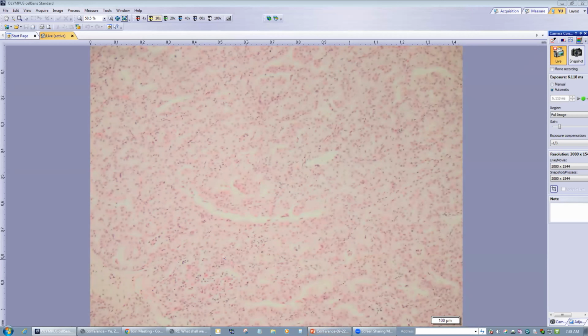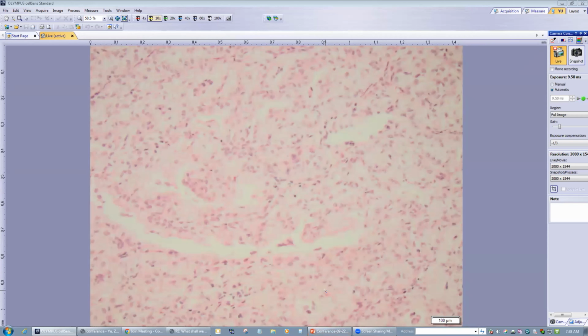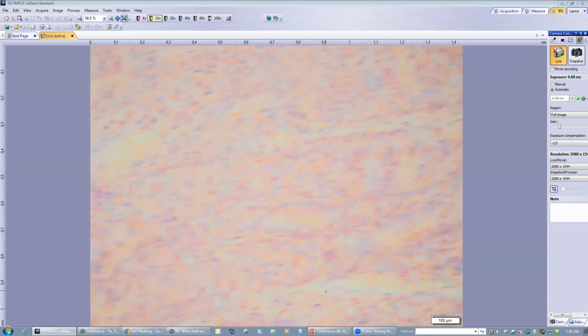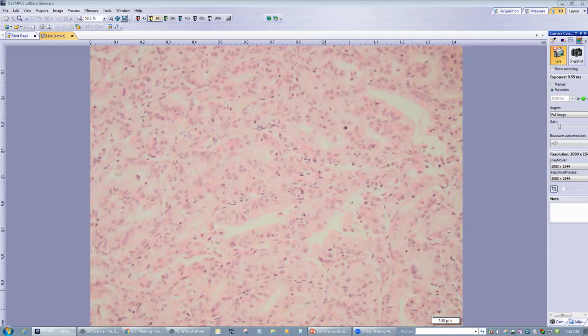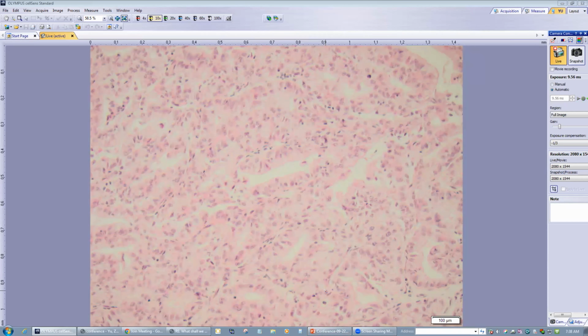So it's a tumor arranged in cords. Some look like papillary structures. This is my collection. It was faded, this slide. Let me just show you the morphology.